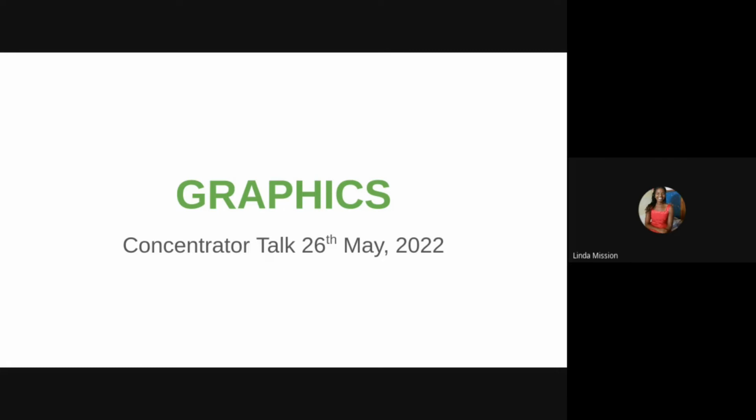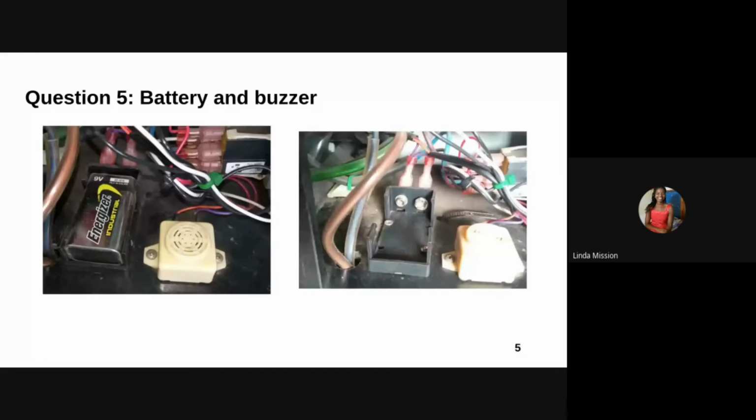So in your case, the buzzer may not be activated due to a number of causes. And one of these causes is a drained battery that powers the buzzer. Usually when the battery is in good condition, immediately after you have switched on the unit, the buzzer sounds for approximately 5 seconds. And if this did not occur, just know that the battery is drained. And you can also verify if the battery is drained by using a voltmeter to check the voltage being produced by the battery.